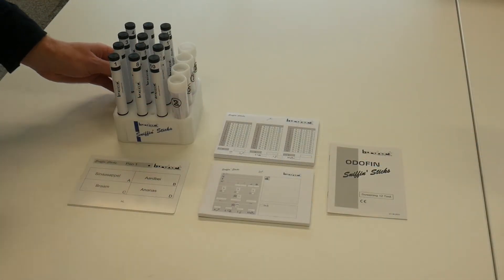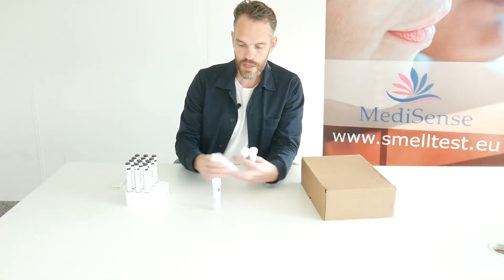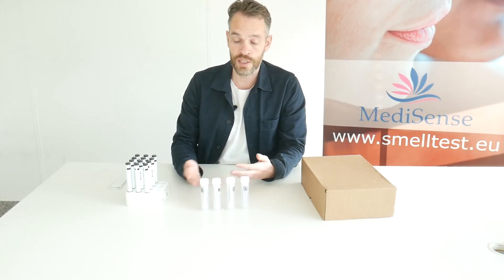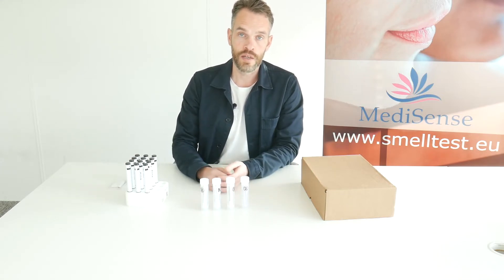But these taste strips can also be purchased individually. As you can see, it's four tubes. Each tube contains 25 strips in the highest concentration of each taste, so you can use that to do a quick taste test.